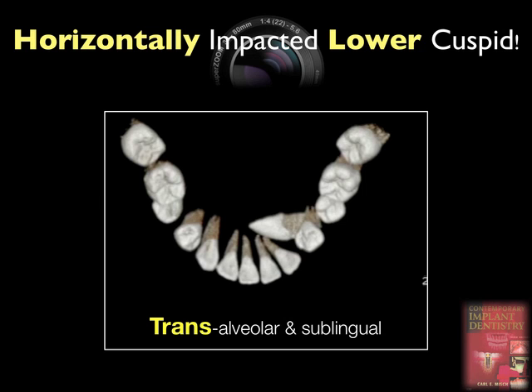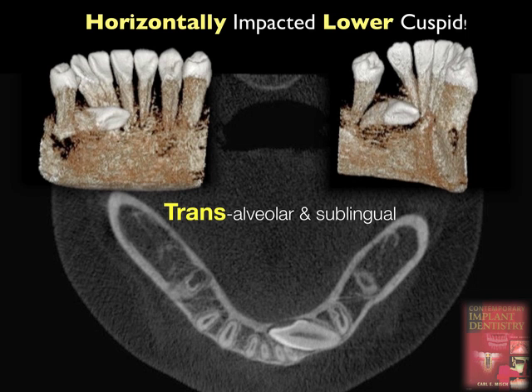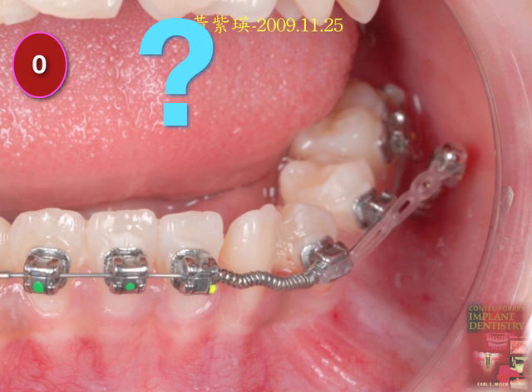So if you look at the 3D, wow, that low impaction is sublingual and transalveolar, and the tip is right on the sublingual artery foramen. Well, don't do that, because orthodontically it already has a very good life. So I don't want to mess with this case. How do you solve this problem, Eric? Oh, it will be quite difficult. Look at this one. Huge.